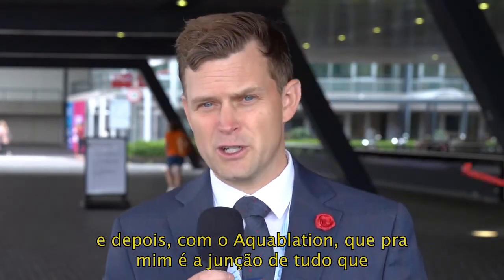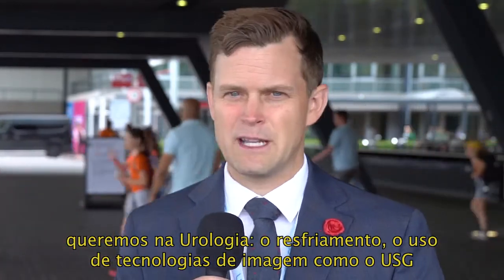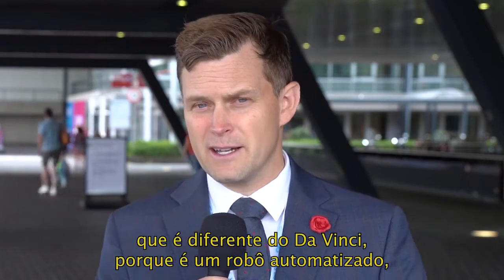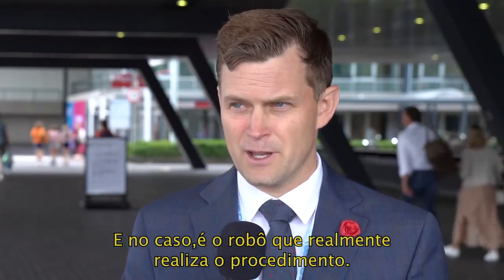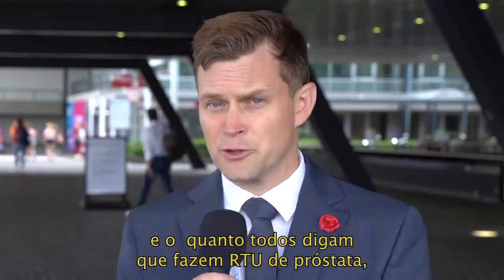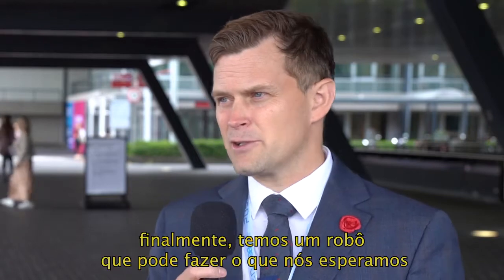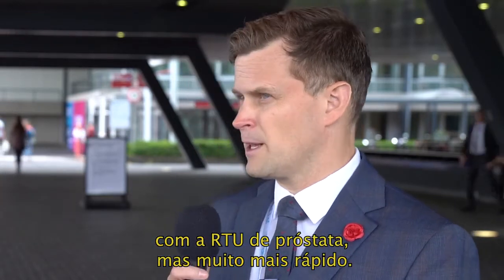And then with aquablation, which to me is the marriage of everything we want in urology: the cool ultrasound imaging technologies and, at the same time, a robot. It's a little different than da Vinci, because it's an automated AI, artificial intelligence, that the robot actually executes the procedure. So everyone out there that's doing TURPs, no matter how good you are, each one of us does it a little bit differently, and the outcomes, the reproducibility, is the big question. So finally, we have a robot that can do what we would expect for TURP, but much faster.